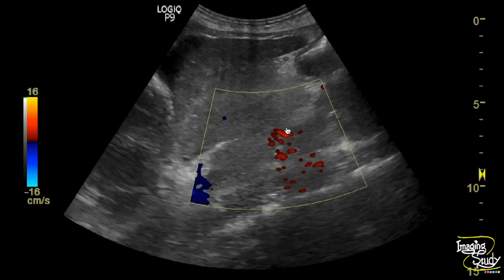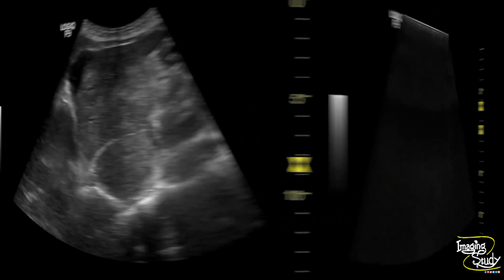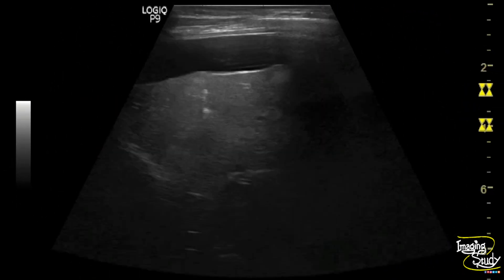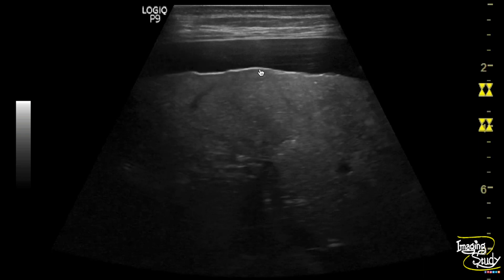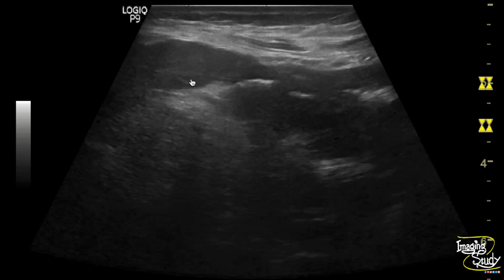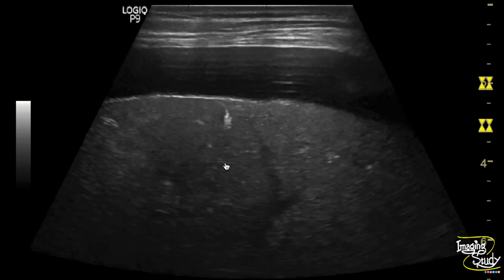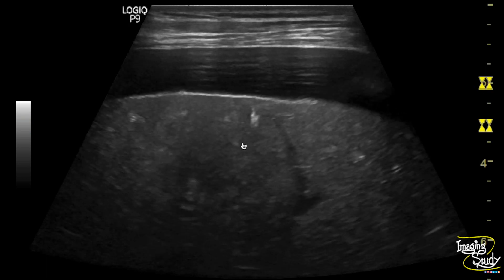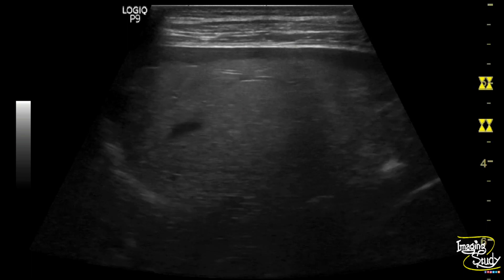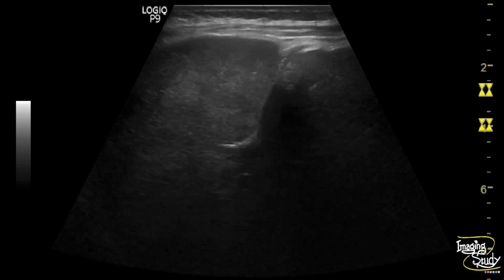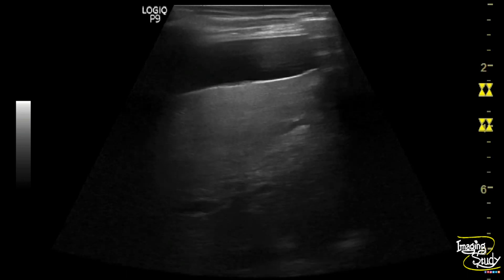You can see this is the hepatic artery. Now we have magnified the image with a high-frequency linear transducer. There is ascitic fluid collection at the inferior border and the hepatic margin is irregular. Multiple hyperechoic lesions are also noted within the parenchyma, which we couldn't see with the curvilinear transducer. There are some echogenic linear striations here — I was a little confused about these, as they looked like pneumobilia or portal venous gas involving the deeper branches, but on CT there was no appearance of air within the liver.